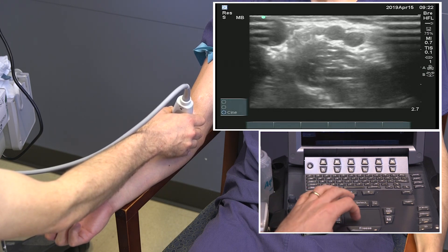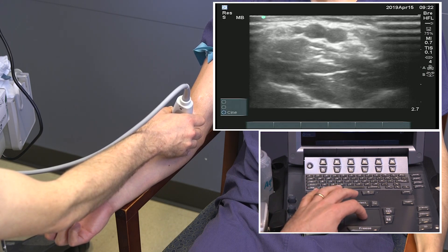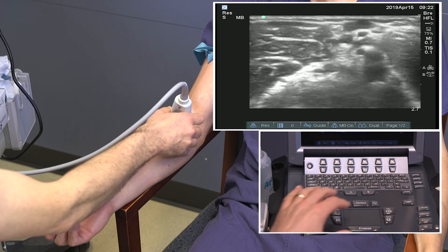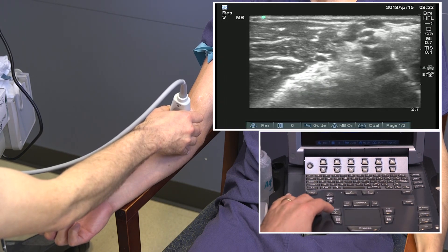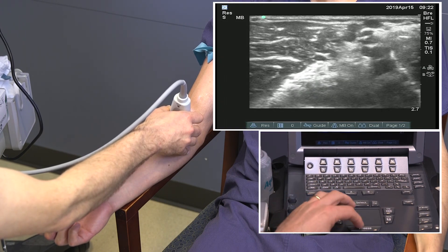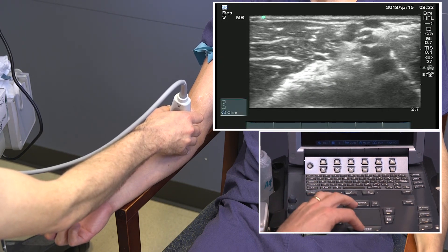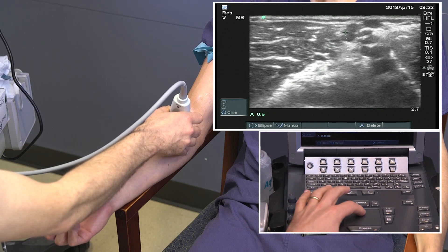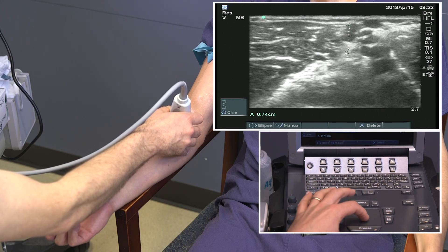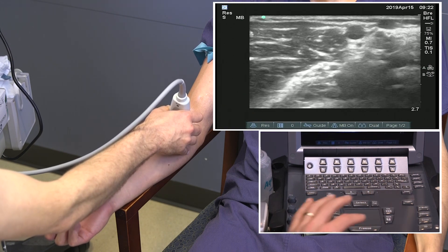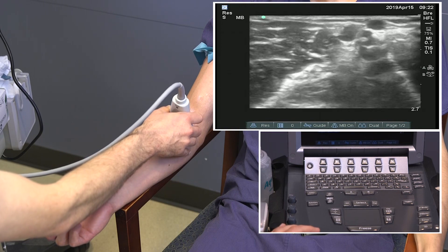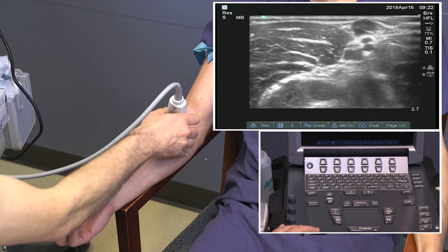Sweeping back and forth, we can see that interplay. Here the cursor shows how the perforator vein goes from the deep vessels and crosses the fascia to join the median cephalic vein.